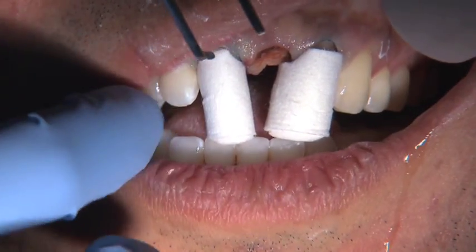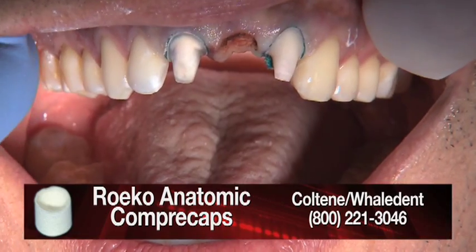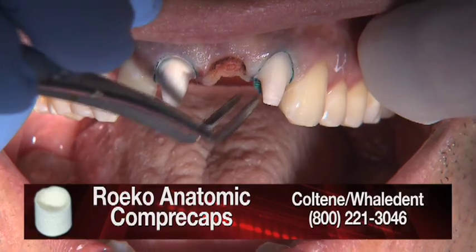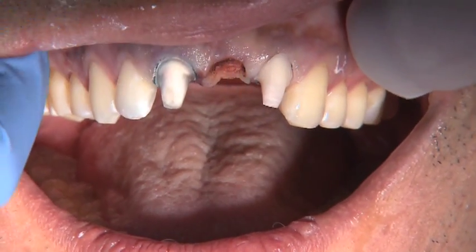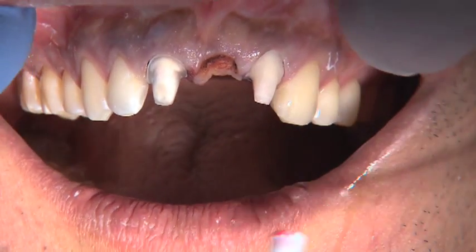This cord is going to stay in place for 8 to 10 minutes while the patient bites on the Anatomic Comprecaps. It's really the cord that's going to provide the space for the impression. That's not going to happen from the bottom cord. The bottom cord is strictly retraction and to stop any bleeding from happening.